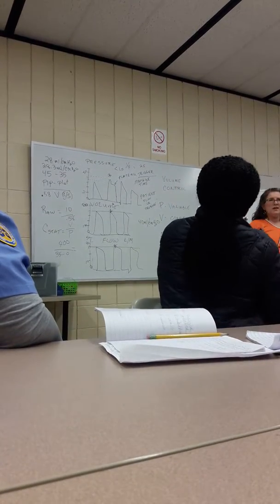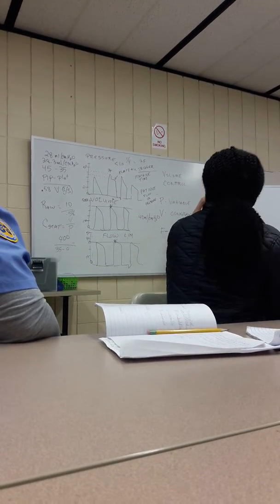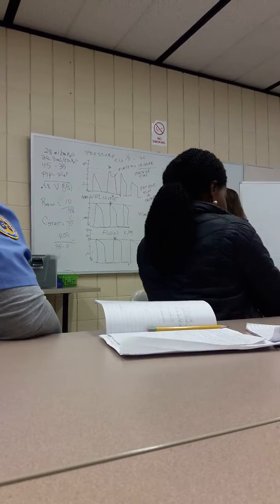Are we good on that? Alright, so there's one more waveform to look at. So we had pressure control, volume control.